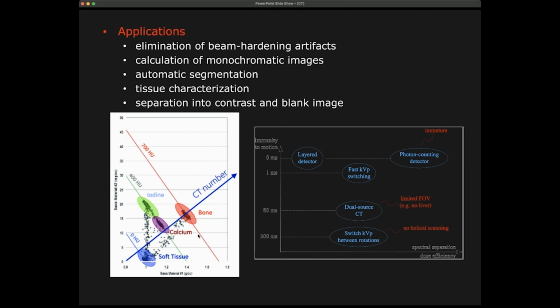The disadvantage, of course, is that this is based mostly on two scans or combining two scans, so potentially you have a higher dose. You really have to take that into account. Also, it always complicates things. So that means that currently this type of scanner is not common. These are special scanners for special applications.